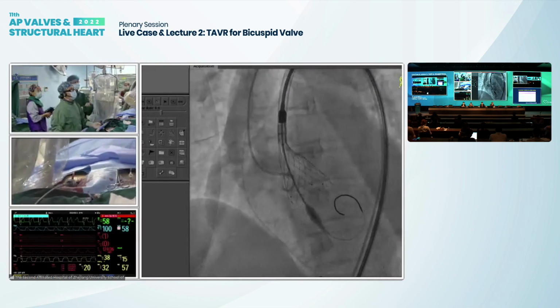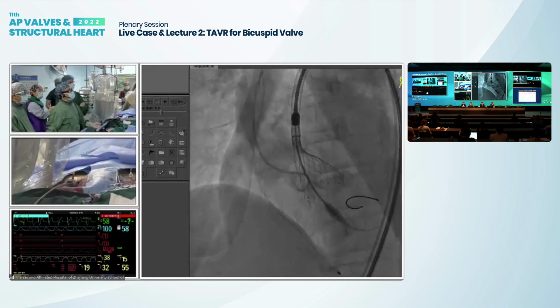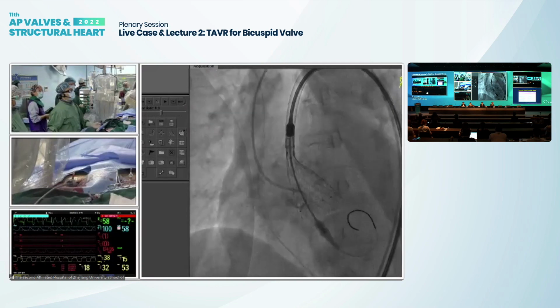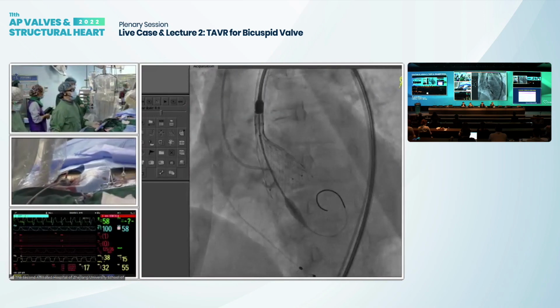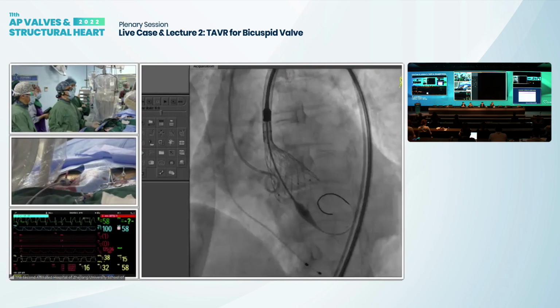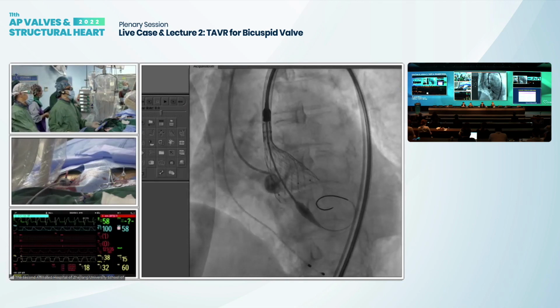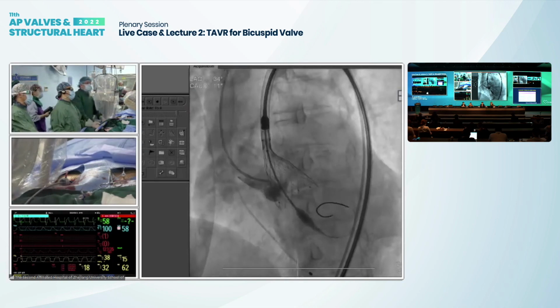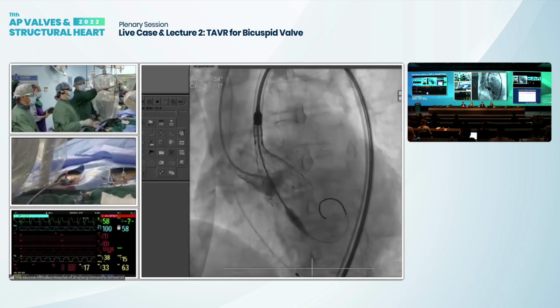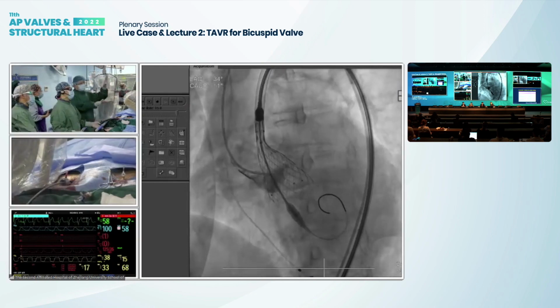Okay. So just a minute. You can release on this view too. That's good. This is the LL view. Yeah, that's right. In this cusp overlap view, the non-coronary sinus is not the lowest one. So it will still have spontaneous adjustment.